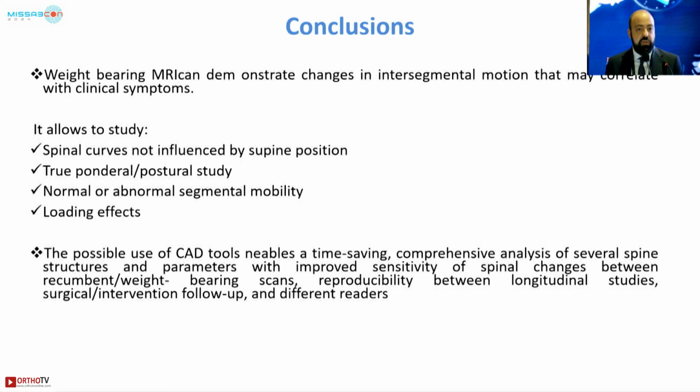And the possibility to use CAD tools is also time saving and can provide a comprehensive analysis of several spine structures, increasing the reproducibility and the comparison with different studies, and also improving the diagnosis and the outcome of patients.